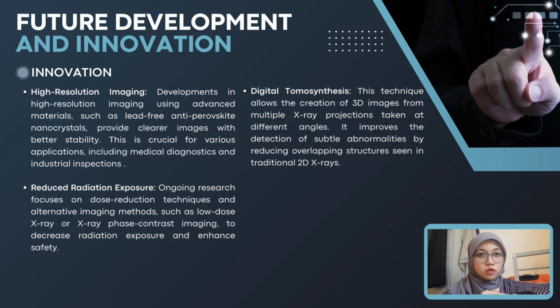And the second one is reduced radiation exposure. Ongoing research focuses on dose reduction techniques and alternative imaging methods such as low dose X-ray or X-ray phase contrast imaging to decrease radiation exposure and enhance safety.